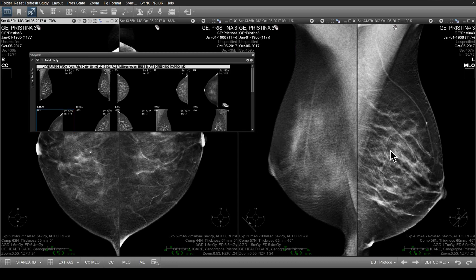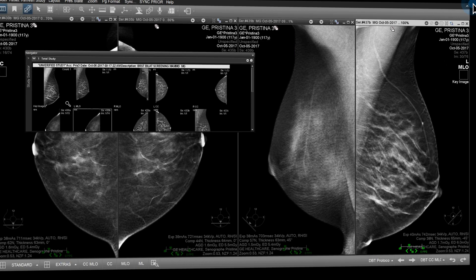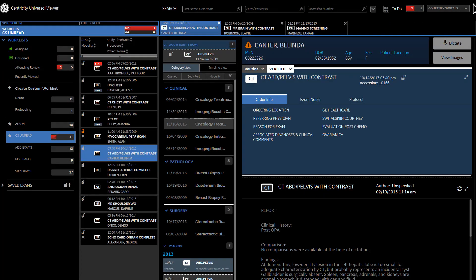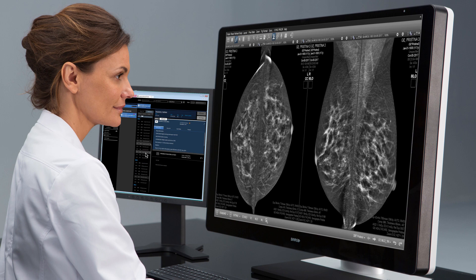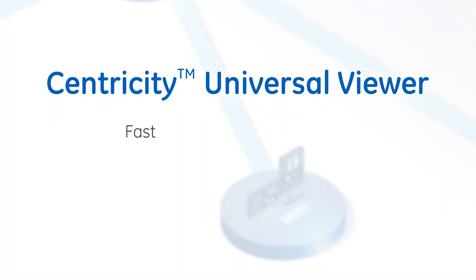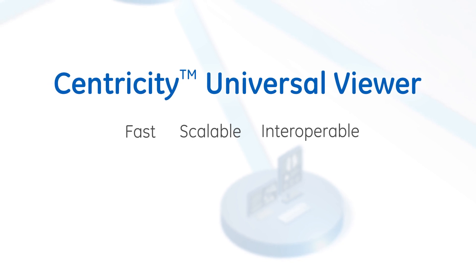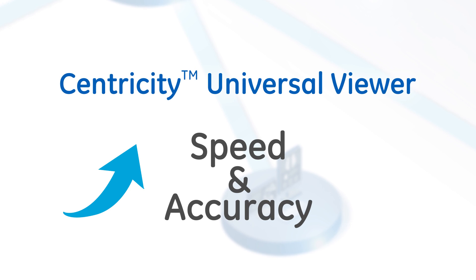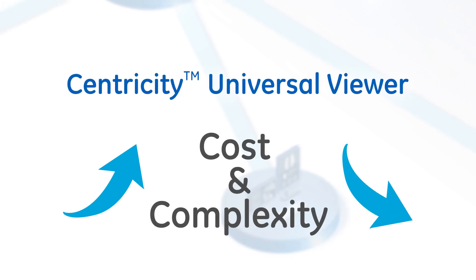Once interpretation of the breast images is completed and the user marks the study dictated, the study is closed and the user is returned to the unread breast imaging worklist. If AutoServe is enabled, the user is automatically presented with the next most important unread exam. Fast, scalable, and interoperable, Centricity Universal Viewer helps enhance the speed and accuracy of breast imaging reads, while reducing the cost and complexity of enterprise imaging operations.